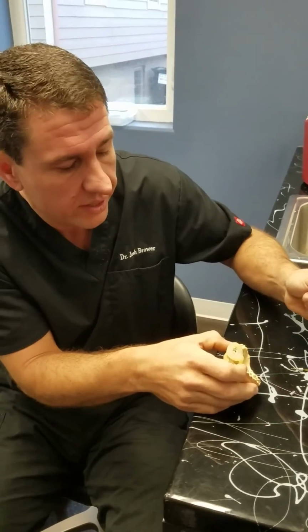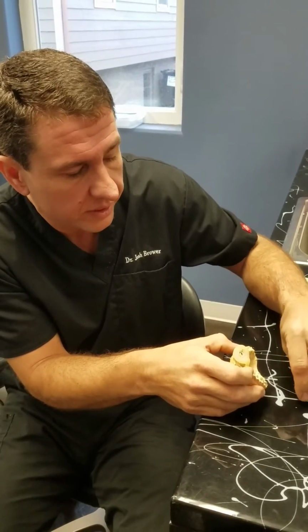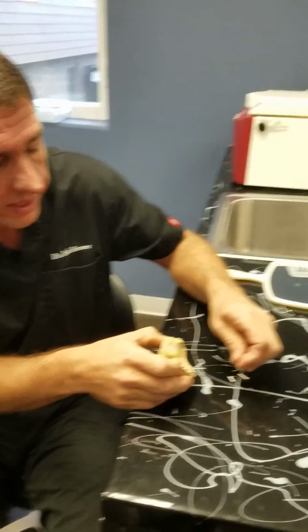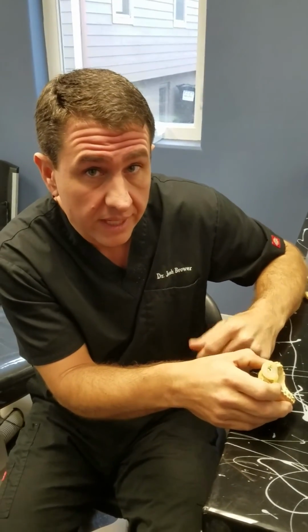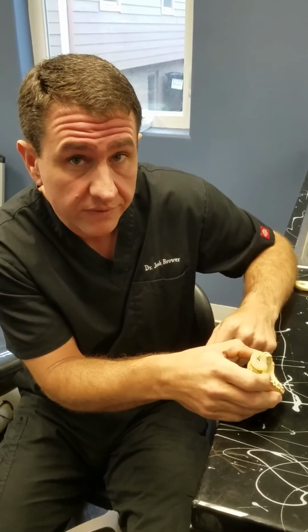If you pull that off and you find that you want to go deeper, just take the next size bushing down, and you know that you're going to drive that implant in 3 more millimeters. That should take it just under the tissue if you need it to.